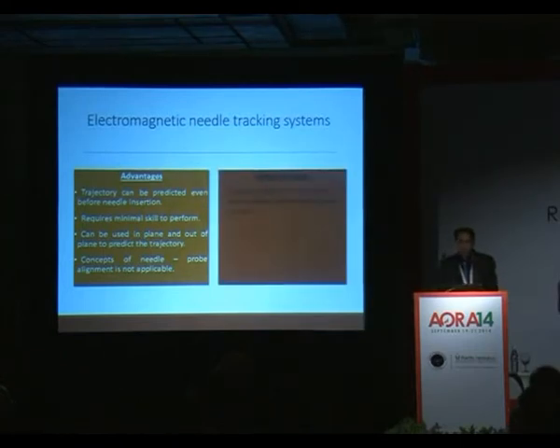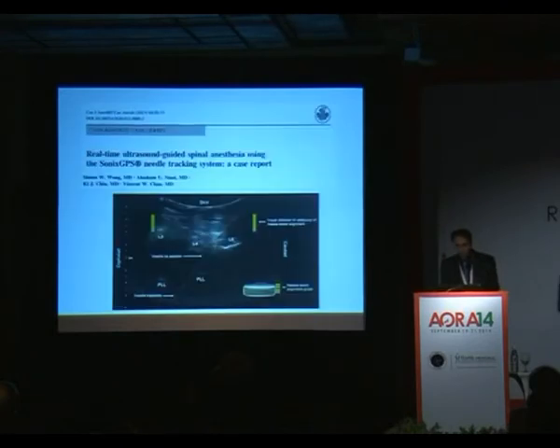Disadvantage, again, these are expensive machines, high-end machines, not really well available, and the needles are definitely different. The electromagnetic field is prone to disruptions if you have a lot of metallic objects nearby or phones and equipment going. Not universally available. And we might just lose everything that we have learned if you use these needles. The in-plane, the angling, all those things that we have learned so far may just disappear.